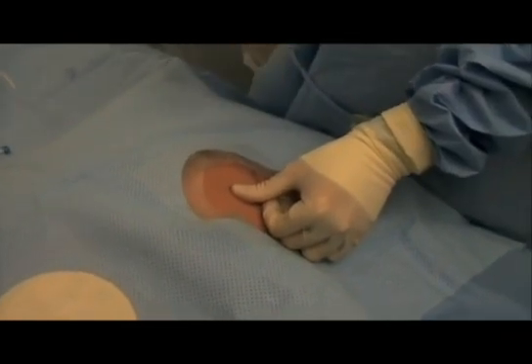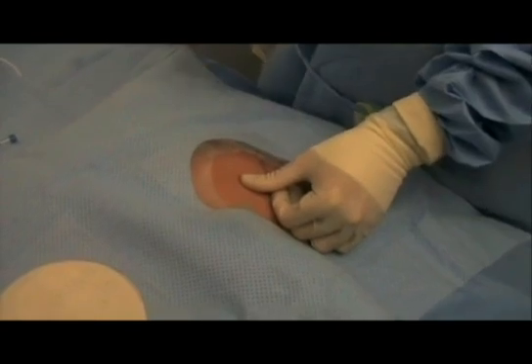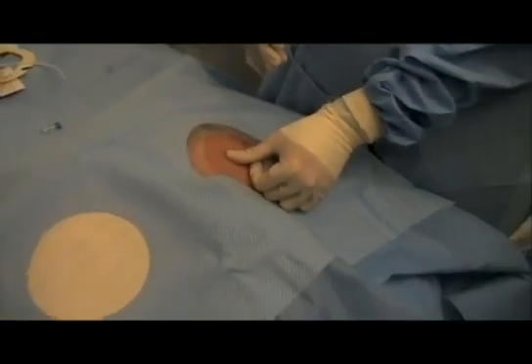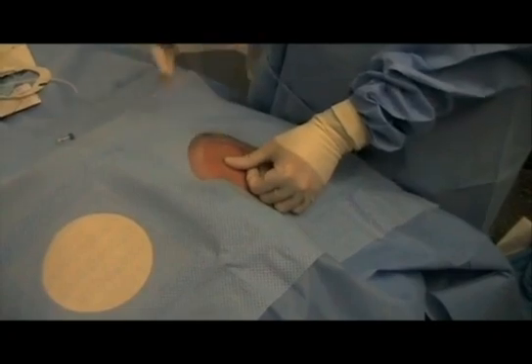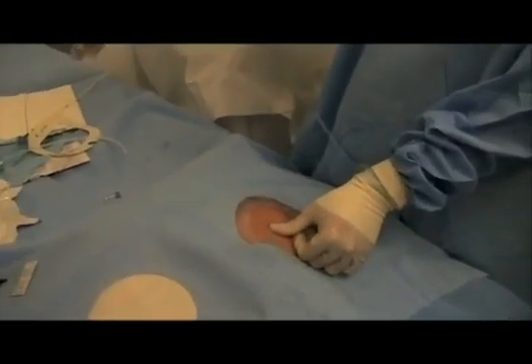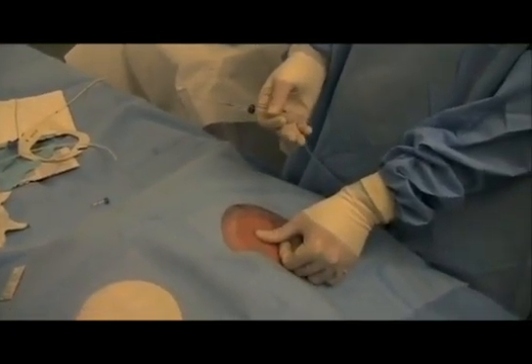Let's discuss the infraclavicular subclavian approach. It's actually my favorite approach for trauma patients — they have a collar on, you can't really do an IJ. It has probably the lowest incidence of infection because the patient is not drooling on it, and it's not underneath their groin like a femoral line would be. So it's a really nice line for patients that are going to keep central lines in for a while.